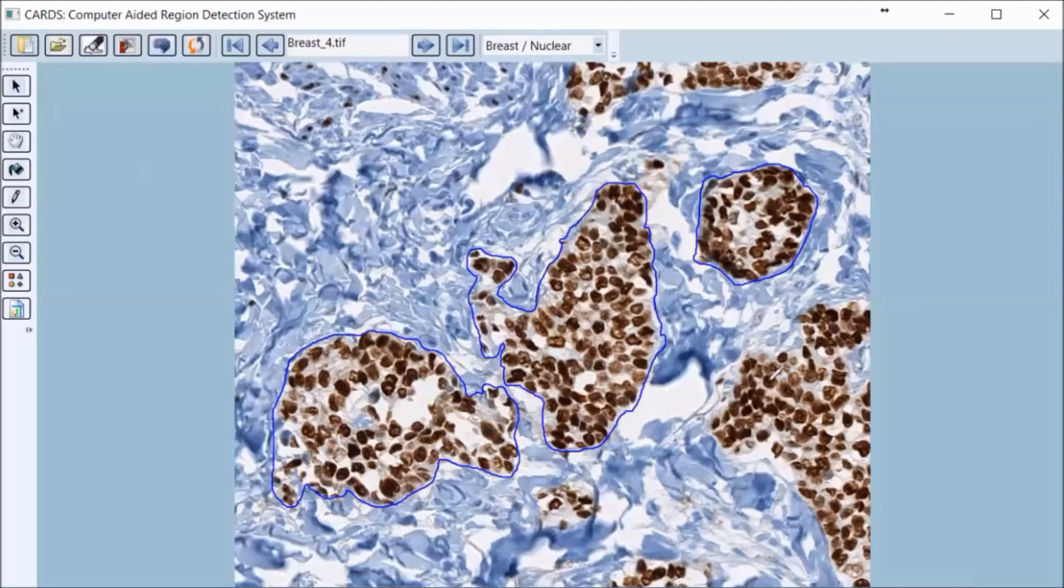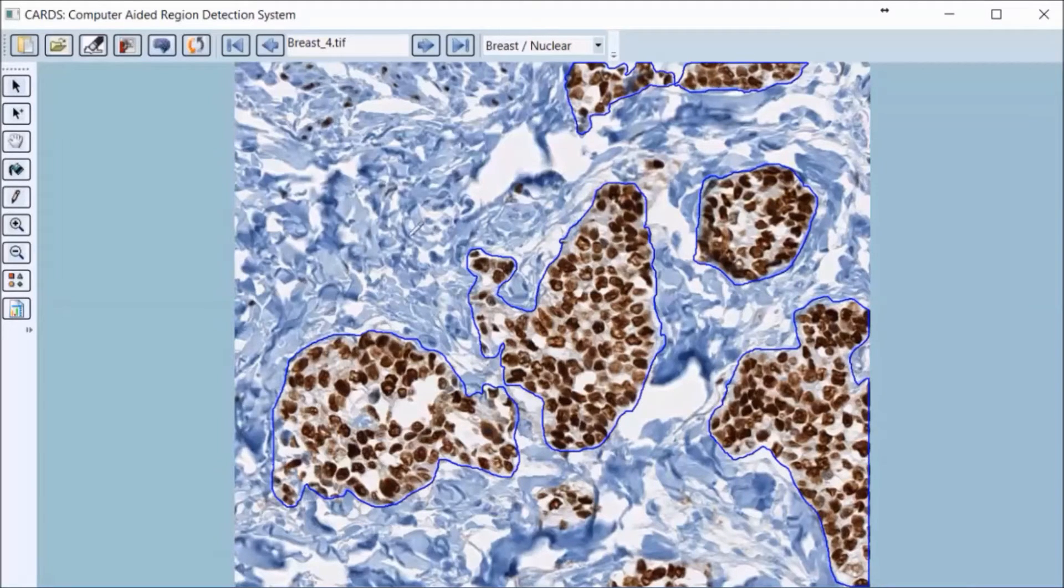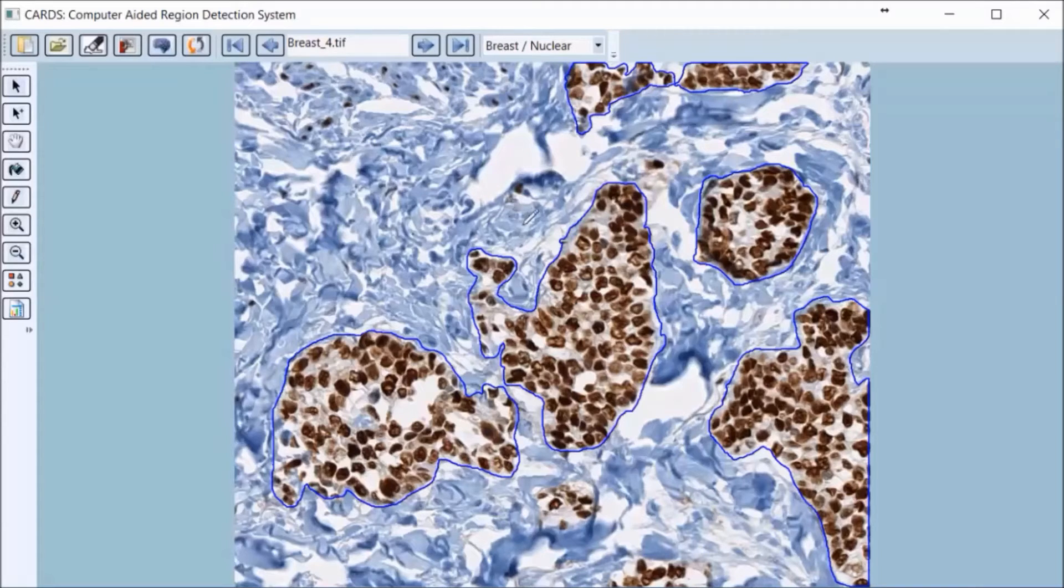If the user clicks outside the tumorous region, the algorithm will reject the selection based on the knowledge that no tumor exists in that space.